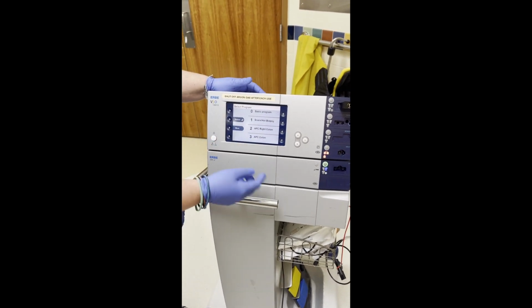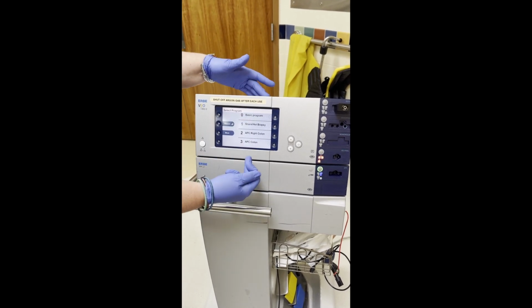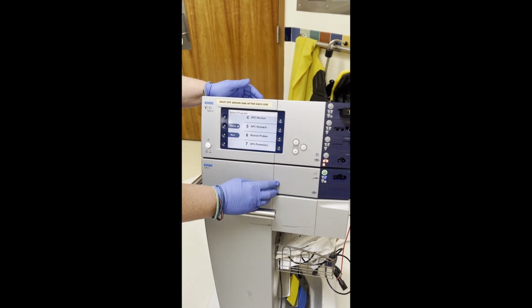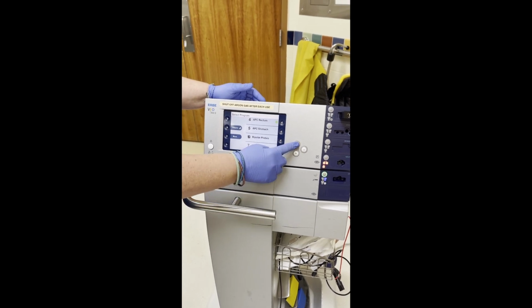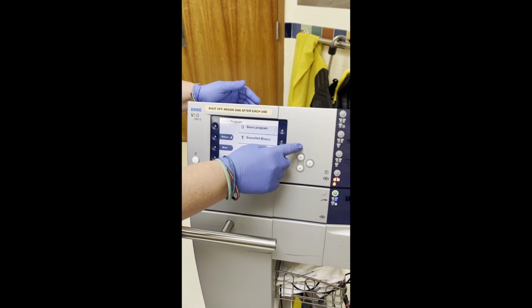Hot snare, you're not going to worry about. APC colon, possibly an APC. But to go down through the list, there are several. You hit this arrow right here, and that gives you the next. One more time, gives you the next. And then you can go back up to the very beginning. So that's how you do those.